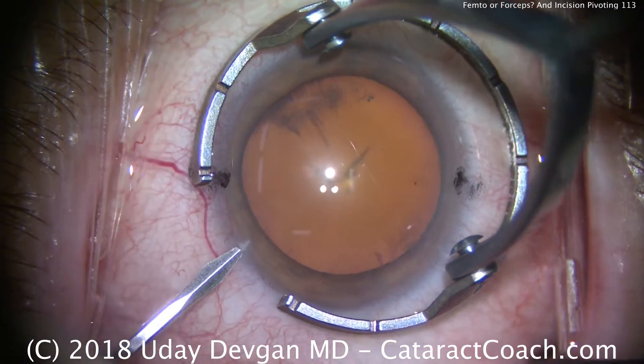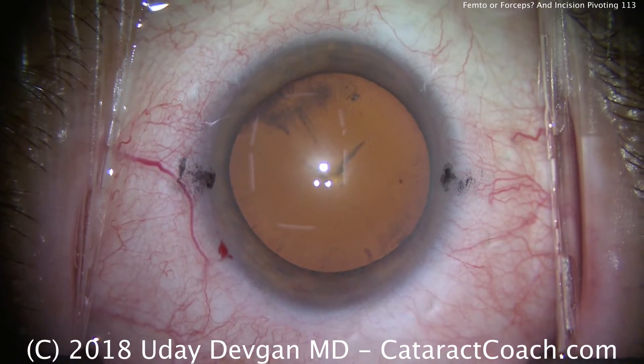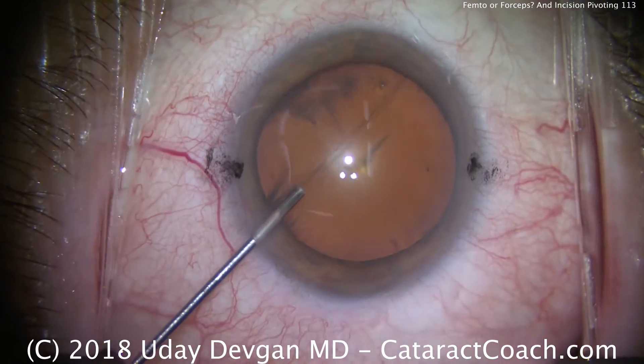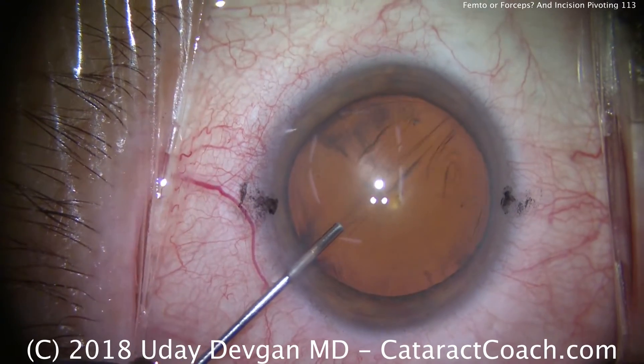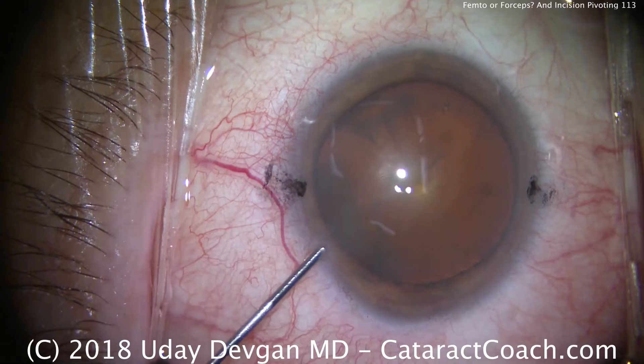It's cataractcoach.com, and we're watching a routine cataract case here. We want to talk about why it's important for young surgeons in training to master pivoting in the eye — that's a very critical thing in cataract surgery in particular.